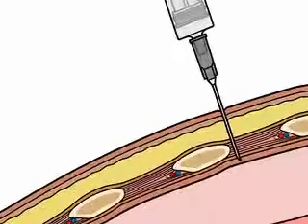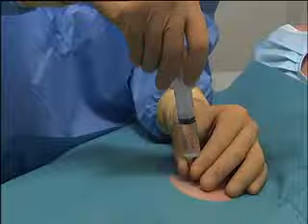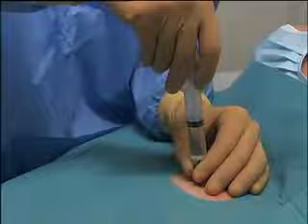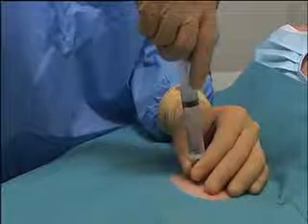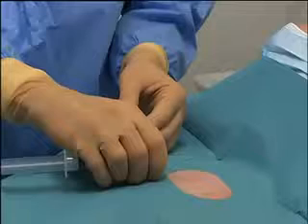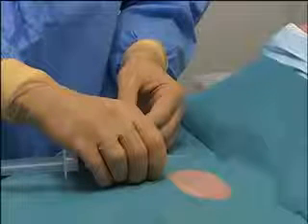This will prevent injuries to the intercostal vessels and nerves, which lie just below the rib. Once you have inserted the needle through the intercostal space, continue to aspirate slightly. When you penetrate the pleural space, air bubbles will appear as you aspirate. Before you remove the needle, note the depth of penetration. You will use the depth as a reference point when you insert the over-the-needle catheter.